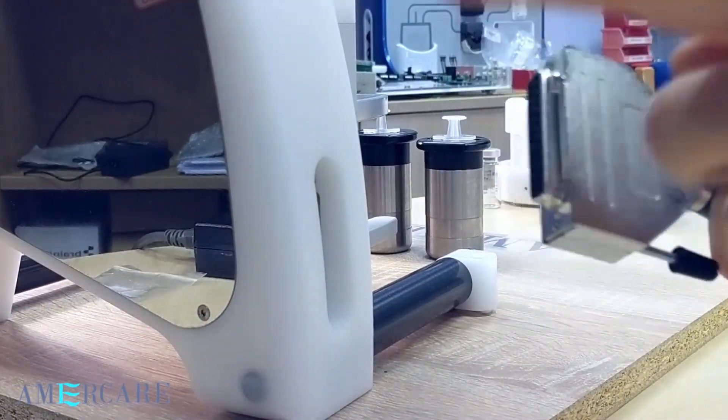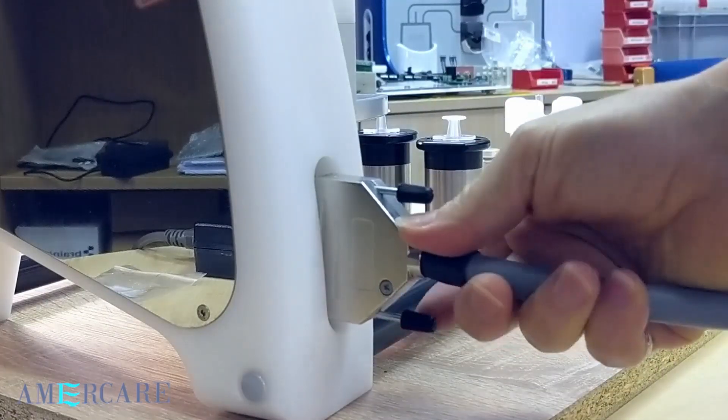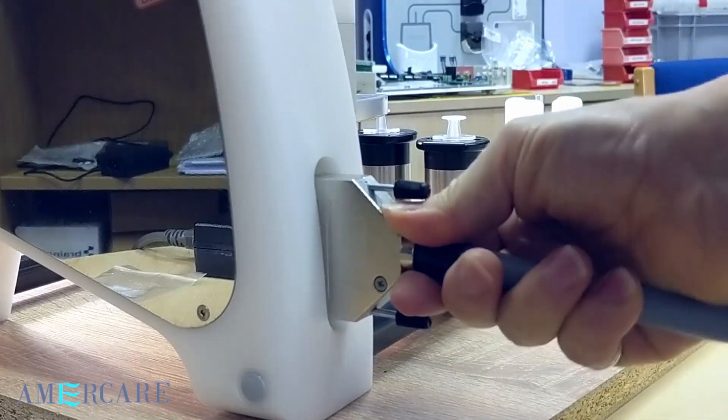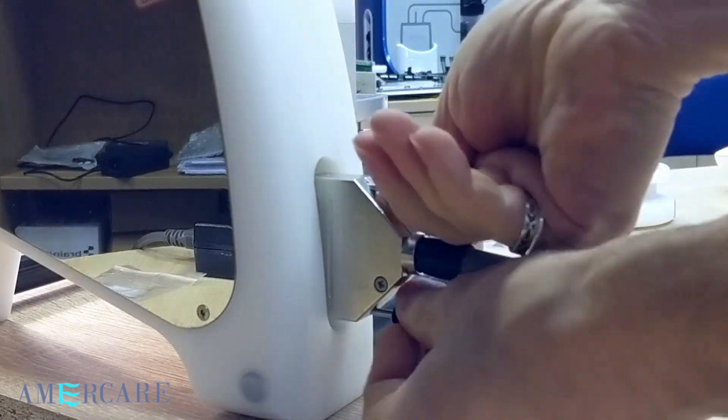At the head end, there is a similar arrangement. The 25-way D connector plugs into the socket. Once again, ensure that the plug and socket are firmly pushed together and secured using the two screws.